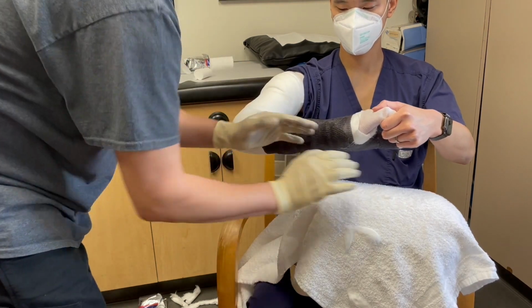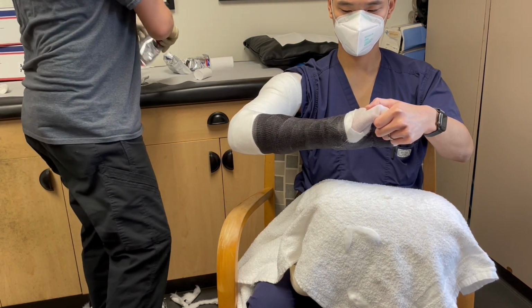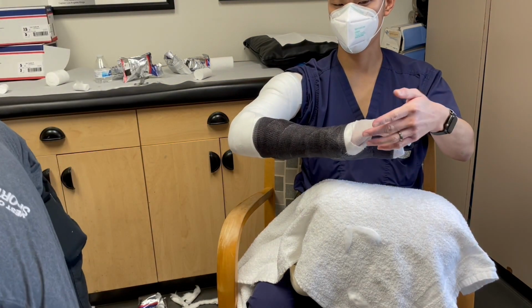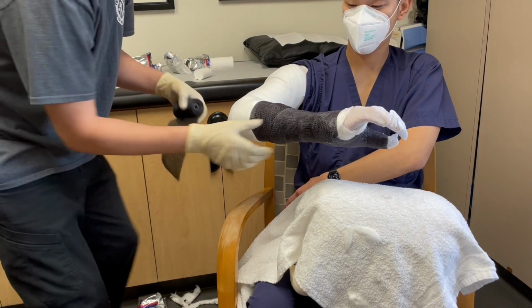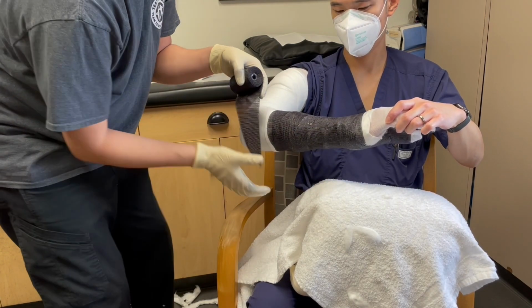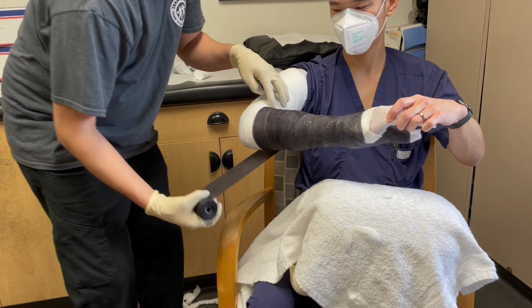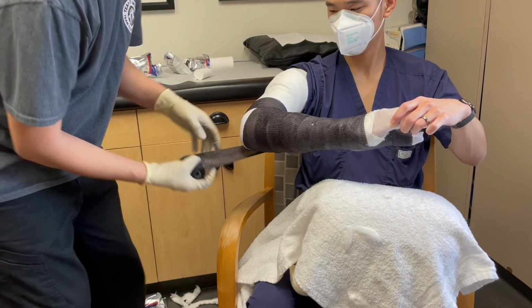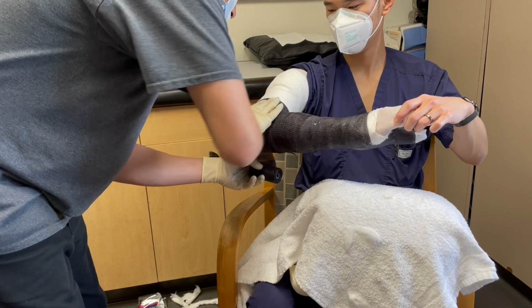As we start the long arm cast, we'll have the patient hold the distal end of the cast like this and try not to make any pressure points. We wrap the elbow like this. We can do the fan fold at the elbow here to add strength to it.